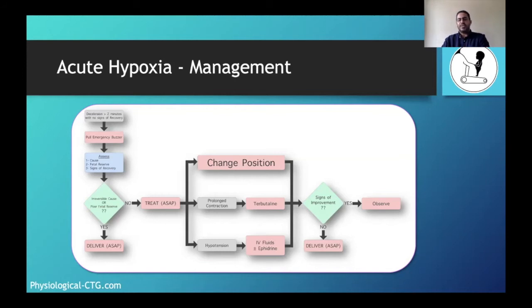If the baseline just seems to be floating back upwards with a flat line, that's not acute hypoxia getting better. When acute hypoxia gets better, variability has to improve. That's the parasympathetic getting relieved, rather than becoming completely flat and now floating back to where it initially was, because there is no parasympathetic anymore. There are no protective mechanisms acting because the baby's brain is that hypoxic.